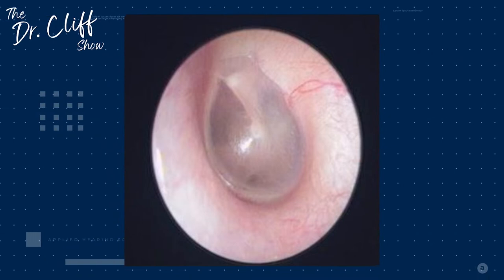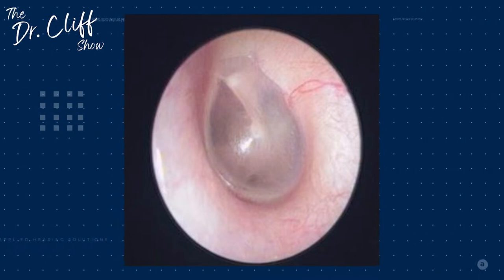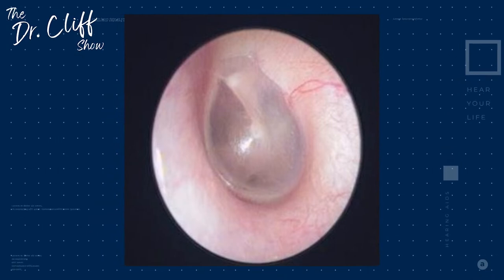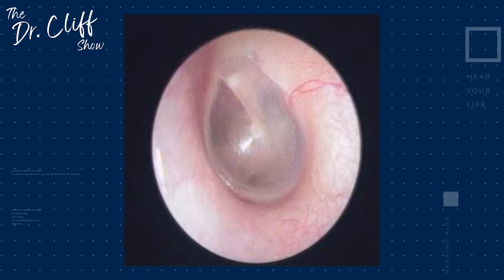Absolutely. No earwax from what I can see at all. You have the little blood vessels that are in there. That is totally normal to see. But if I looked inside of an ear canal like that, I'd be like, okay, your outer ear is looking fantastic. I have absolutely no issues with this. I can move you down to the next portion of the testing. Right. But oftentimes that is not what we see.